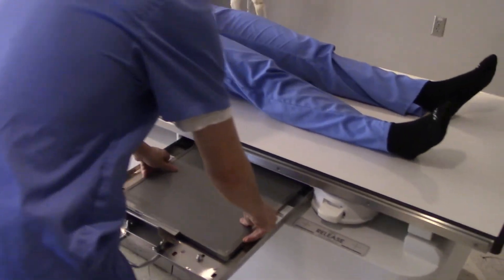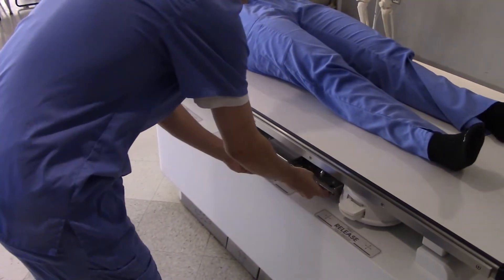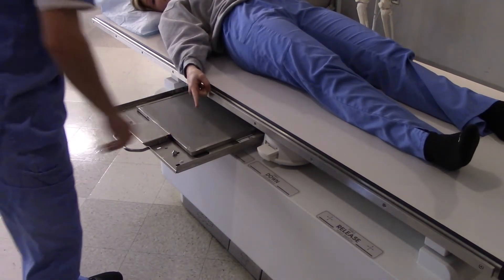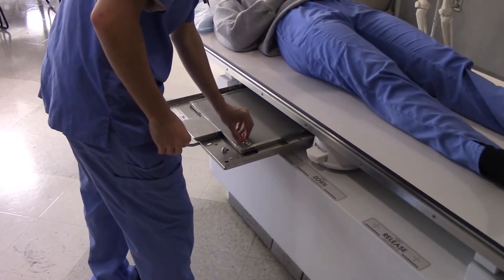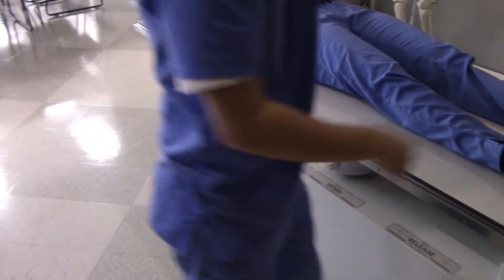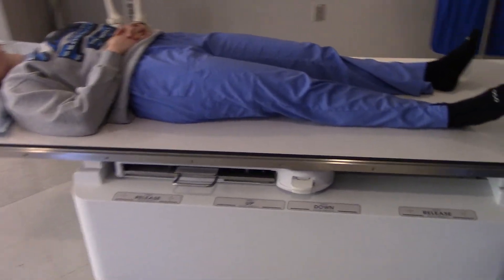Our technologist is going to put the image receptor in crosswise. Where should we put a marker on this thing? Bottom right-hand corner — yeah, that's a good idea — that way we'll be sure it's out of the way of any anatomy we wish to capture on this image receptor.